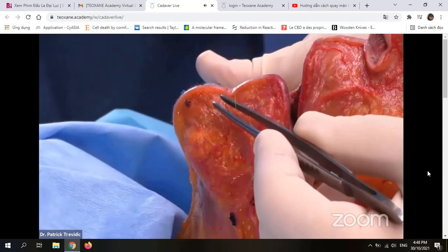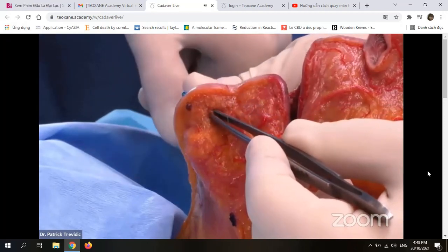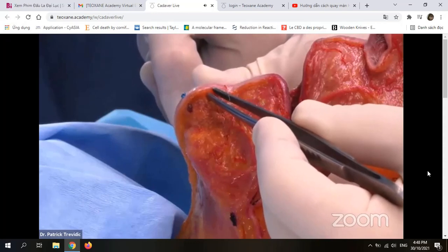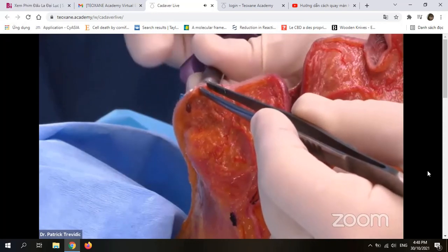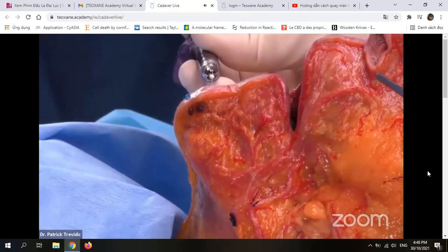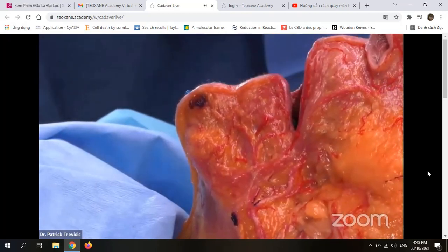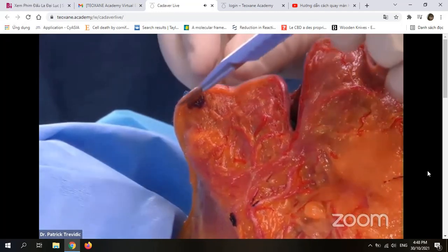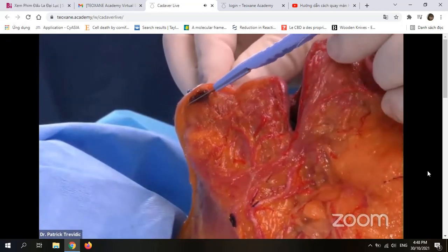And if I do a fan technique here, going here, you will see that if Sasha pushes a little bit more, you will see a second drop of HA. Stop. So you see, this is my superficial injection.